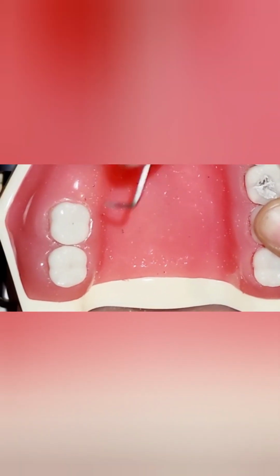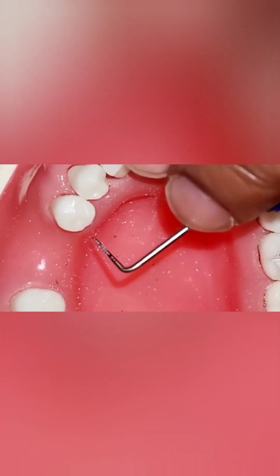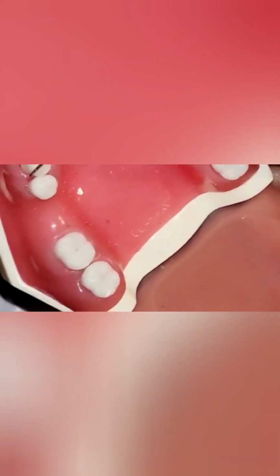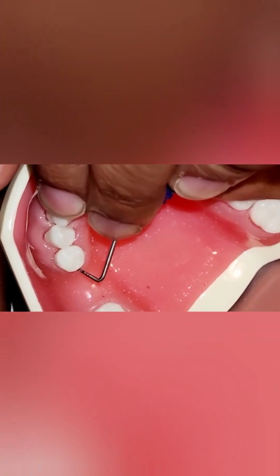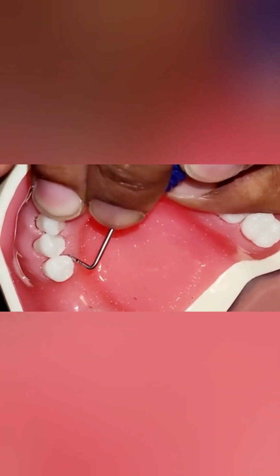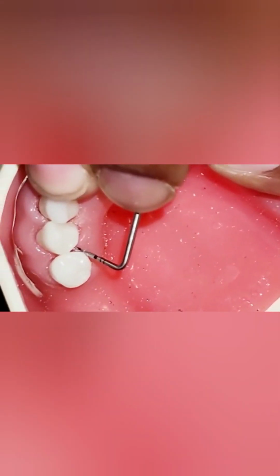We have a 5. Again, we're skipping tooth number 19 because it's missing, and we're going over to our second premolar, number 20. Let's move his head just a little bit. We have a 7, a 6, followed by a 7.